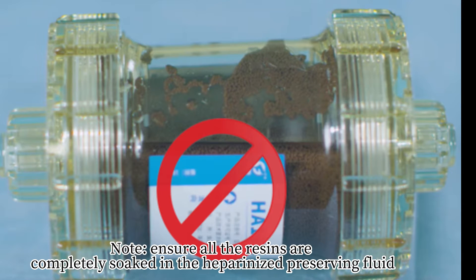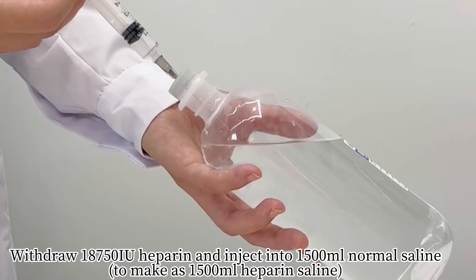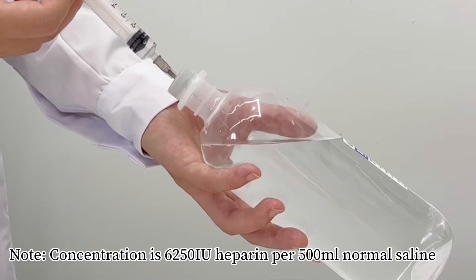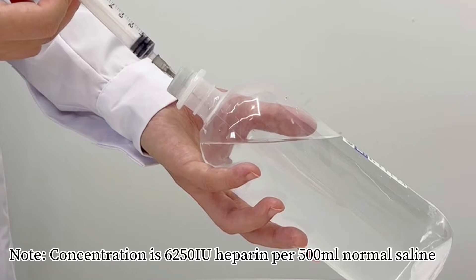Note: Ensure all the resins are completely soaked in the heparinized preserving fluid. Withdraw 18,750 international units of heparin and inject into 1,500 ml of normal saline. Note: Concentration is 6,250 international units of heparin per 500 ml of normal saline.